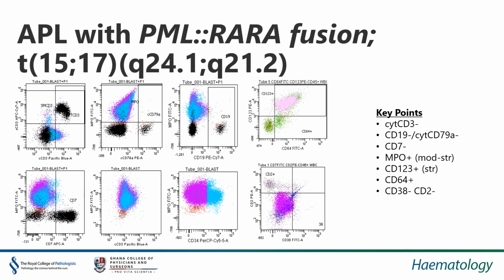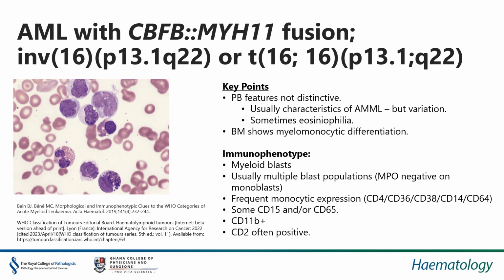So this is a bone marrow film in AML with inversion 16, showing a myelomonocytic differentiation. There are two mature vacuolated eosinophils on the left-hand side in this picture here. One has a non-lobed nucleus, and an eosinophil myelocyte has some granules with some basophilic staining, which is quite characteristic. And this is an MGG stain photographed under ×100.